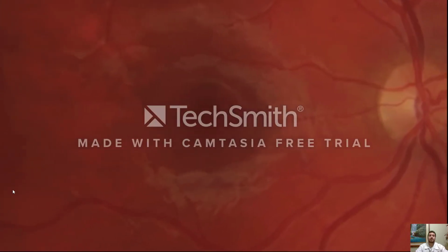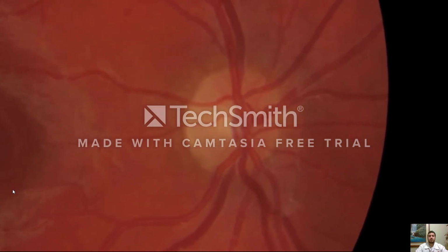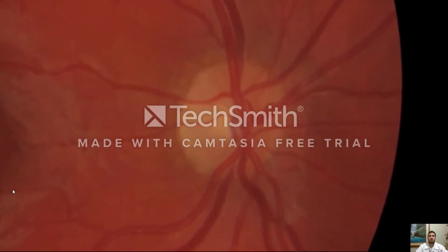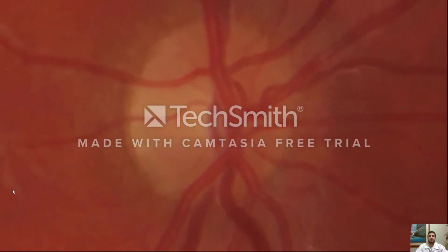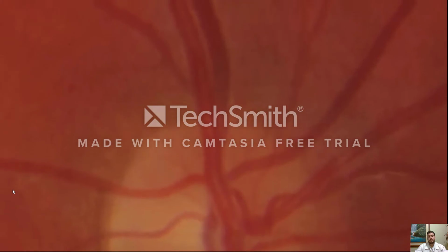Over to the side here, this slightly unusual round structure is the optic nerve head. You can see that it's pink around the edge, but quite pale in the middle. The optometrist will look closely at the optic nerve, because this pallor can sometimes indicate early glaucoma. You can also see quite clearly the retinal veins and arteries.